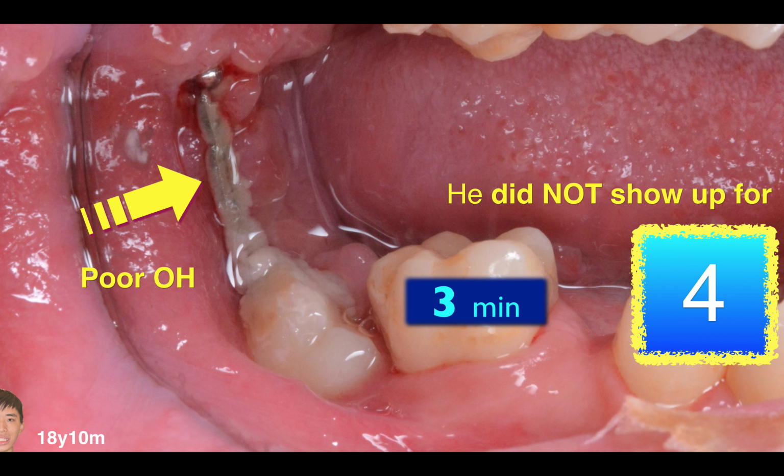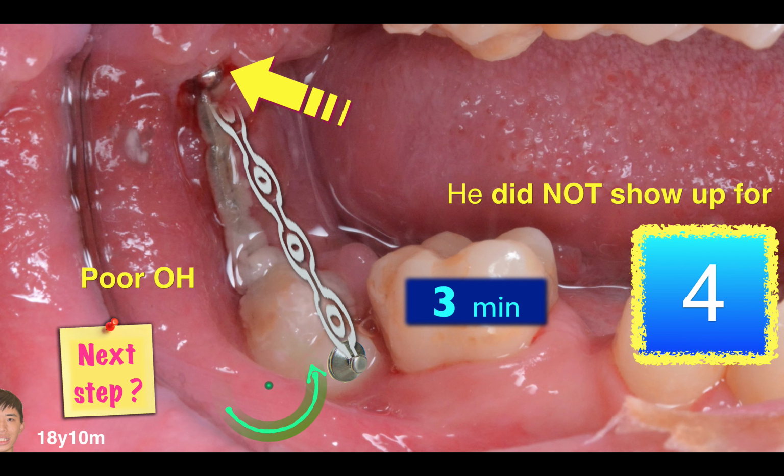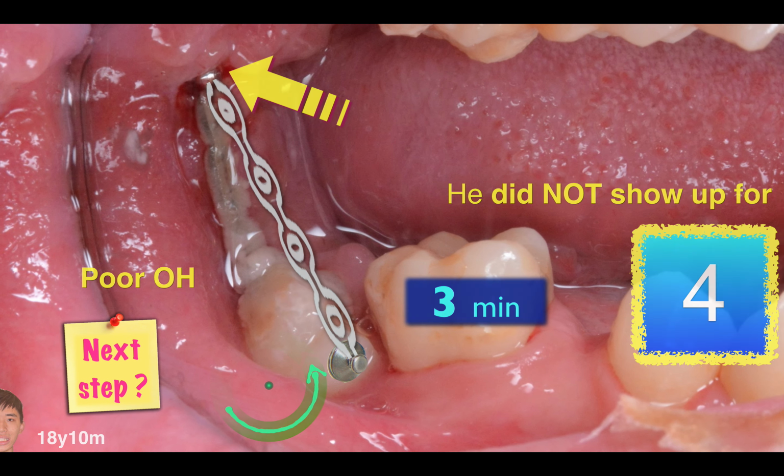Three minutes. We want to get the job done, and we also want to take a photo, and we also want to educate this patient. You need a brush. What I did is I needed more moment to upright it, so I decided to put a button right here. And with this button, I hook up a new power chain. And we're done. Three minutes.